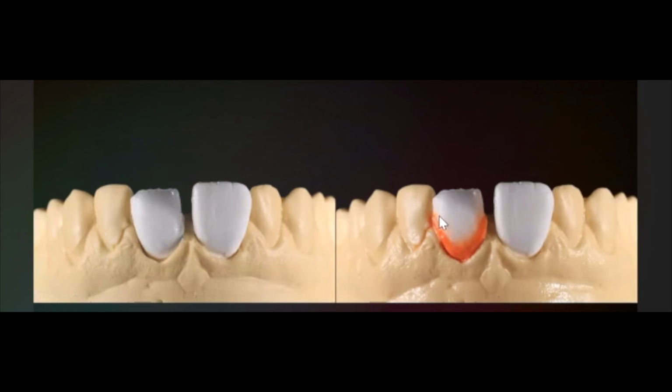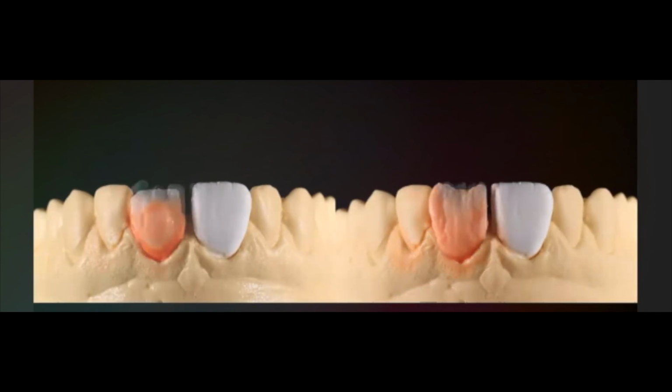Then we proceed with cervical translucent. We start first with cervical translucent. I will explain why later. It was very important for this case to achieve chameleonism. So we start first with a clear cervical translucent, then dentine, then secondary dentine, opalescent dentine.